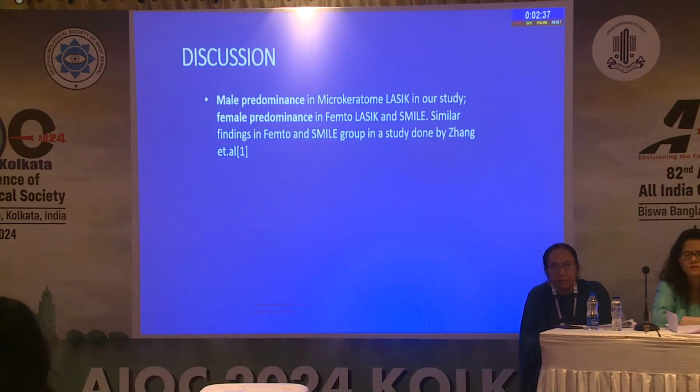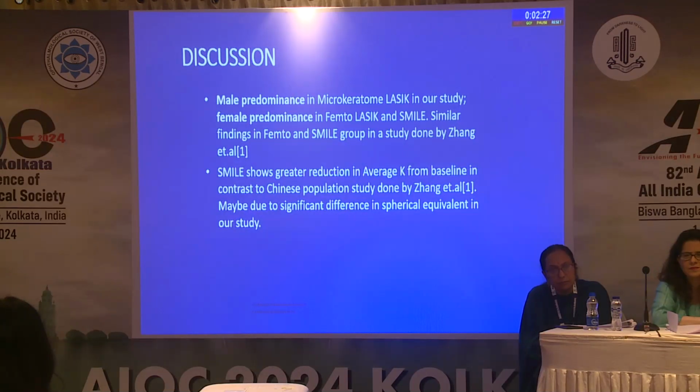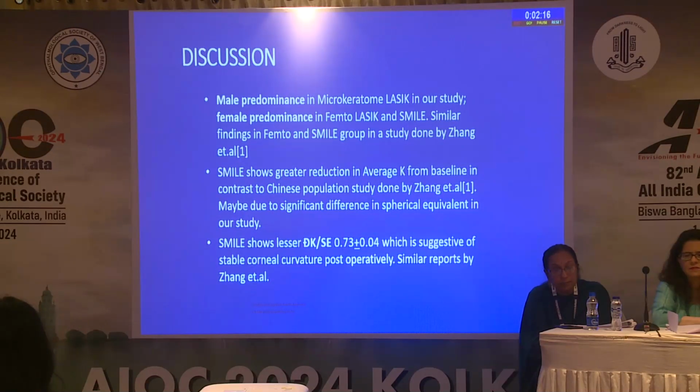Male predominance was seen in microkeratome LASIK in our study, and female predominance was seen in femtoLASIK and SMILE. Similar findings are seen in the femto and SMILE groups in the Chinese population too. SMILE shows a greater reduction in average K from the baseline in contrast to the Chinese population, but this may be due to the significant difference in the spherical equivalent in our study. SMILE shows a lesser delta K by spherical equivalent, which is suggestive of a stable corneal curvature post-operatively.